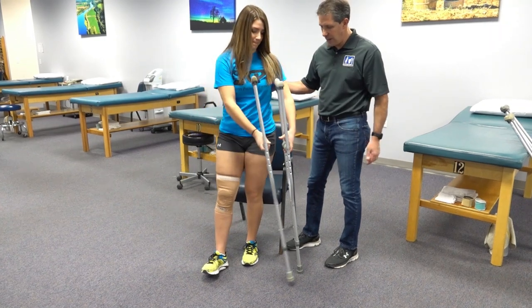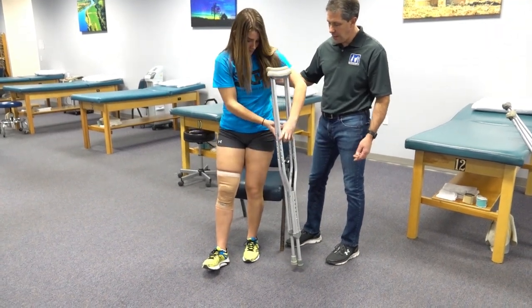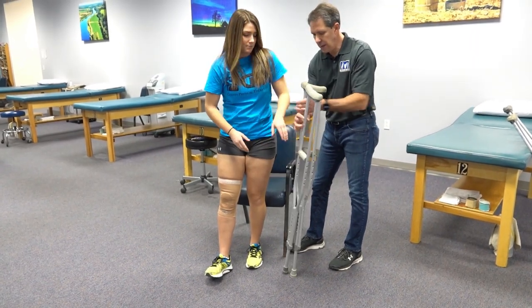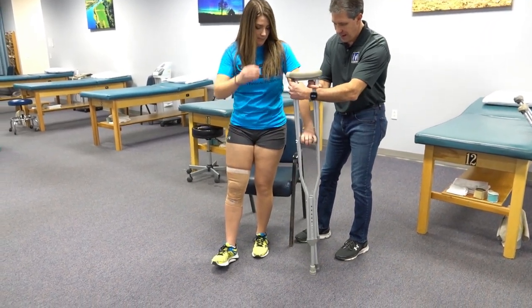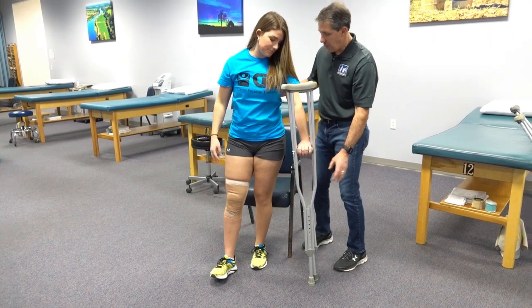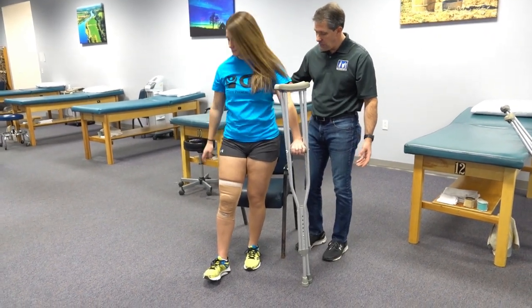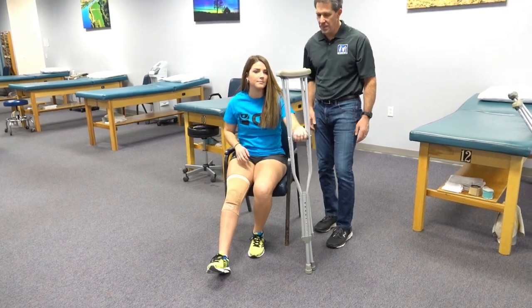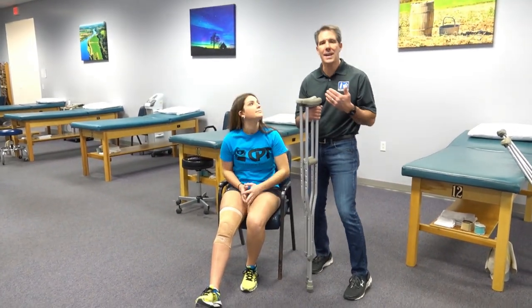Bring that crutch to this side so both crutches go on the good side, and your hand is going to be just like that. Now you're going to be reaching back for the chair, bending at the knee, and sitting right down — good. And then you're all set. That is how we get out of a chair and into a chair with an armrest.